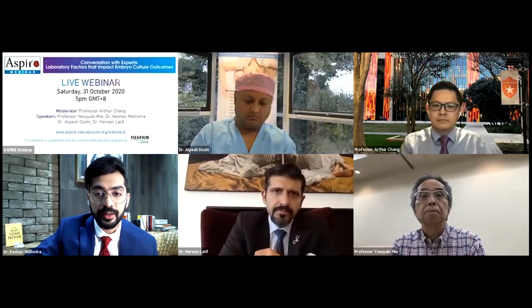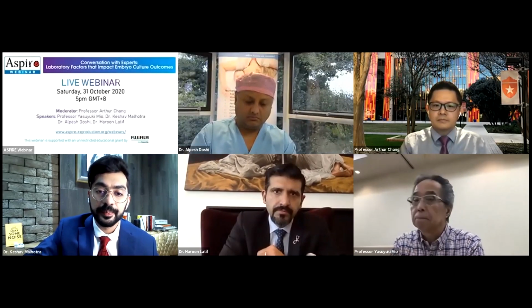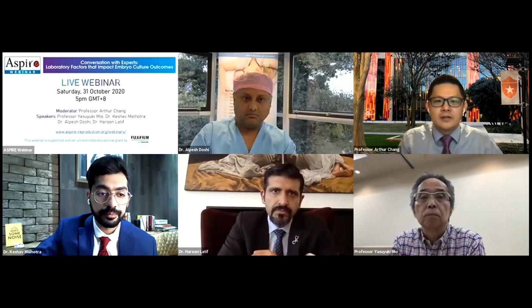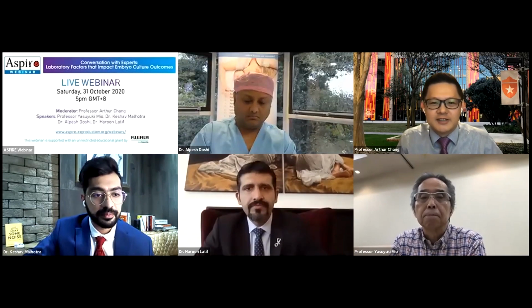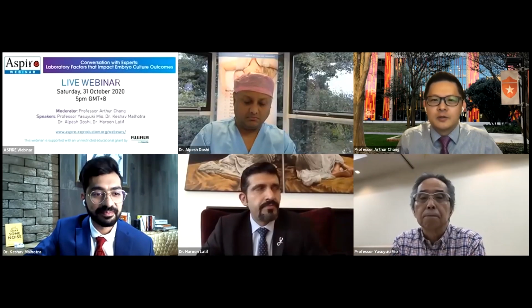Nothing less than 200. Maximum is obviously your manufacturer guidelines. And that's an excellent point. Yeah, and I want to say that not just in developing countries, even in the United States, a lot of clinics want to save on the cost. You know, so 200 microliter would be your recommended minimum.